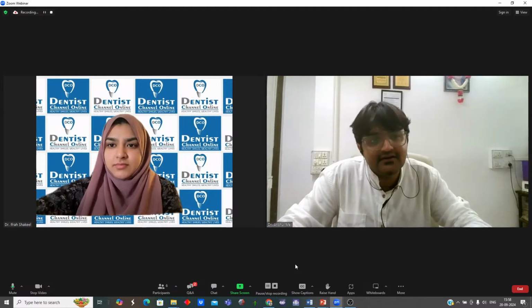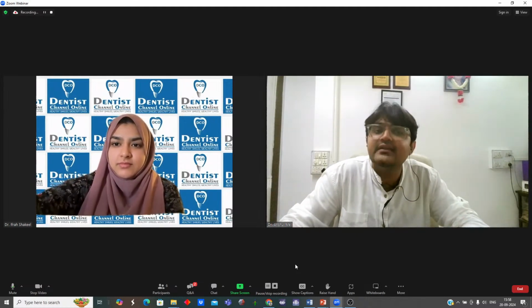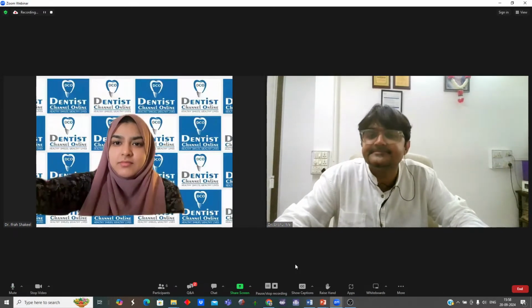So we place 3 implants for the overdenture, with locator or ball socket, we are going for that, and bar supported we are also doing. So those are the two options we are doing.